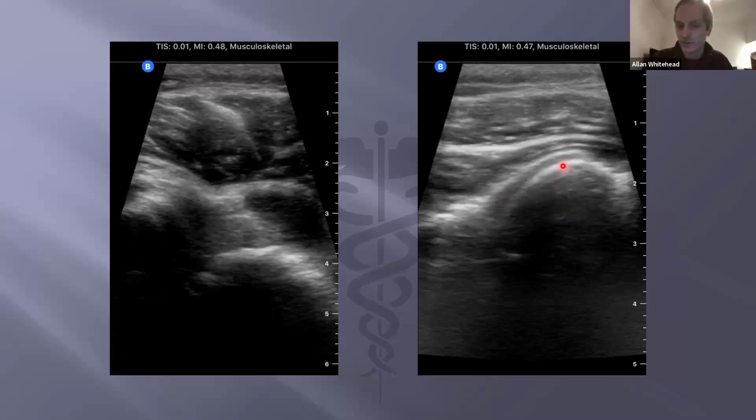Even here where it looks like it's not lining up that well post reduction, even though posterior positioning is common, you can still see that it's well less than 1 centimeter difference between the line of the glenoid lip and the top of the humeral head. So within the normal range.